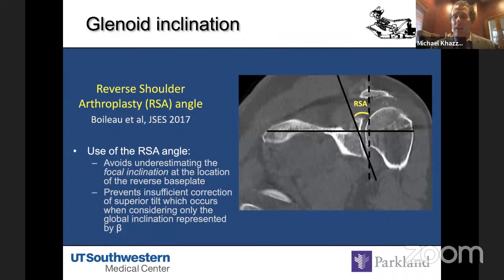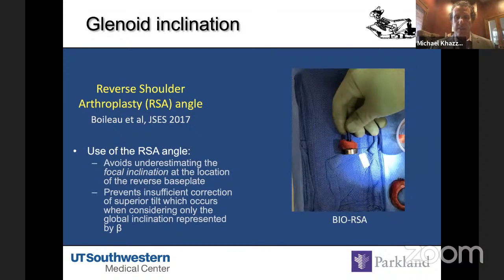So you have to relateralize the joint line, and this can be done with either bone or metal, or you can basically play it where it lies and correct this with bone and leave the bone where it is with this angled bio-RSA technique.